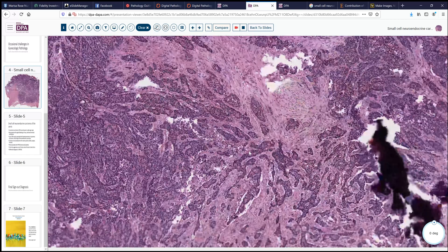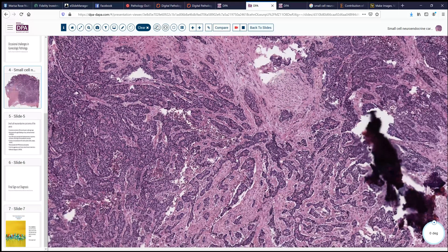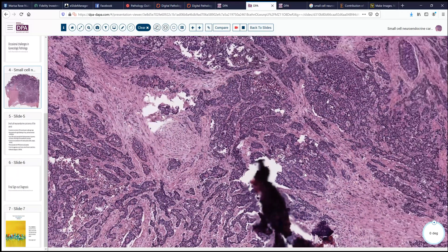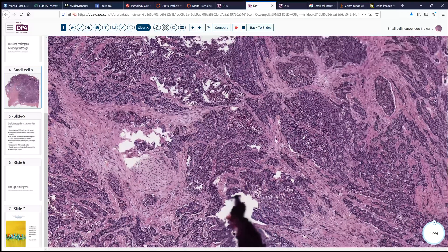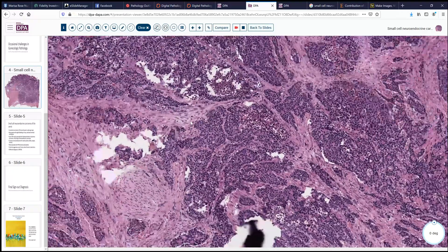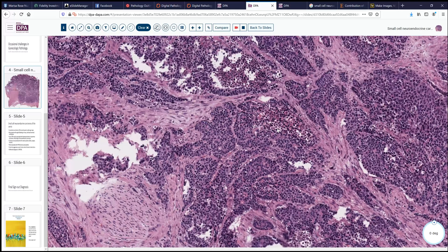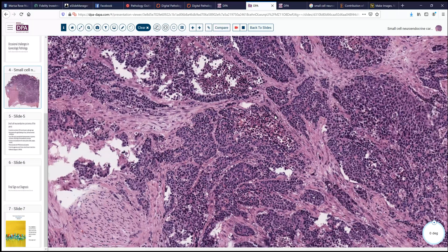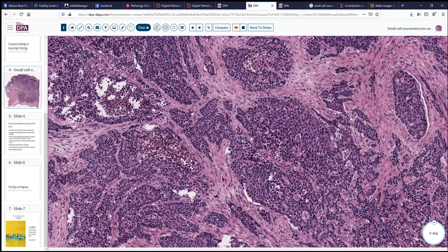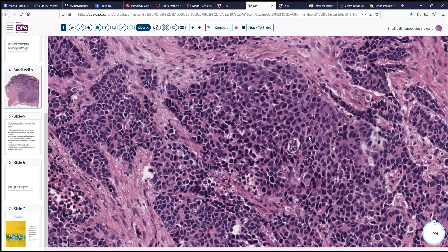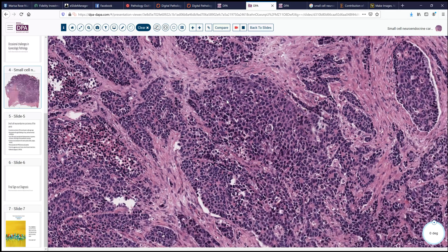Looking a little bit further, here we can see this sort of insular pattern. Here again, broad areas of necrosis of this tissue, and then just very high-grade carcinoma: fairly small cells, single cell necrosis, nuclear molding, and so forth. So this suggests a very interesting differential.